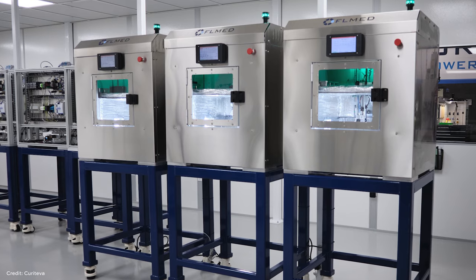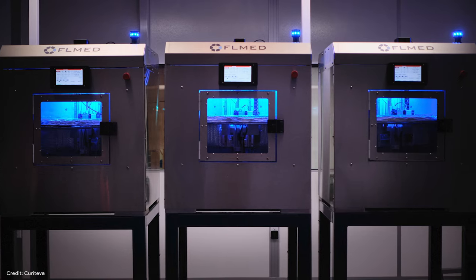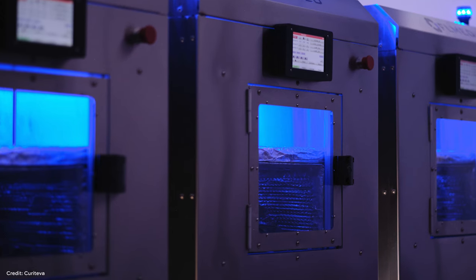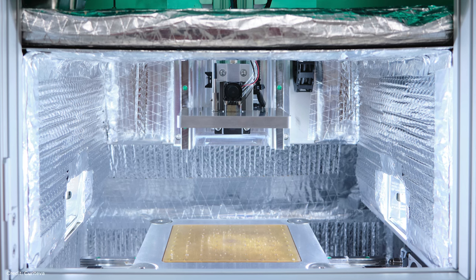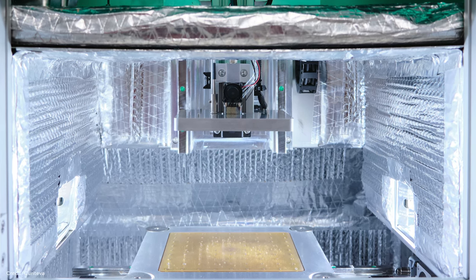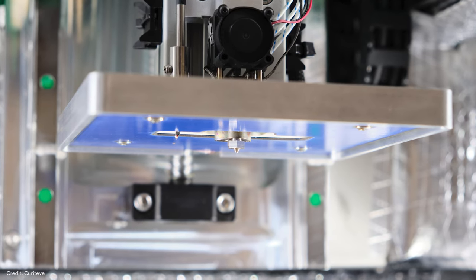So we've already got a dozen printers made. We have a clean room space that will allow us to put up to 30 and more than enough to address our capacity needs. And since we have all our instrument sets developed and built in-house, there should be no delay in launching a fuller set of not only cervical, but lumbar interbody implants.